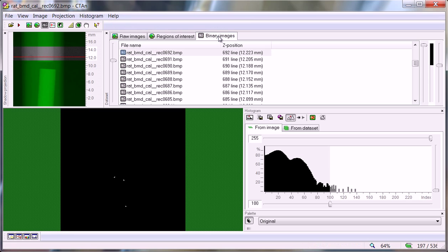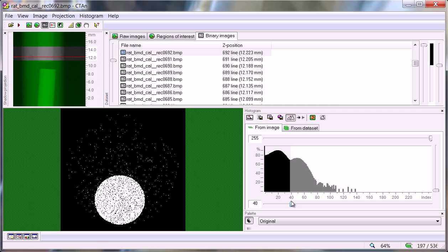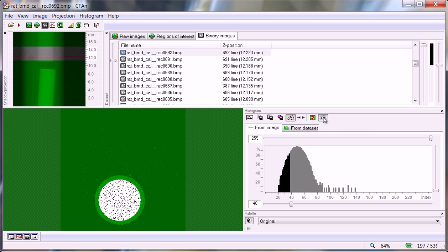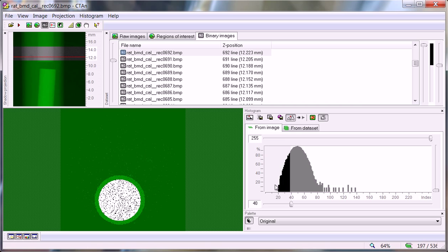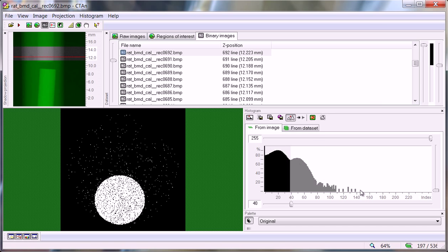Moving to the binary image page, the threshold value that we choose is not very important because we are going to be measuring the whole contents of the region of interest. Note that previously you may have seen three tabs above the histogram display: from image, from selection, and from dataset. Now there are only two — there's been a small simplification. The button at the end of the row under histogram is the toggle VOI view. If I click on it, the binarised display is restricted to the region of interest. Clicking again removes that selection. This has the effect of what was previously done by the selection tab, so clicking this restricts the histogram to only the selected ROI circle. Clicking out again and the histogram covers the whole image.